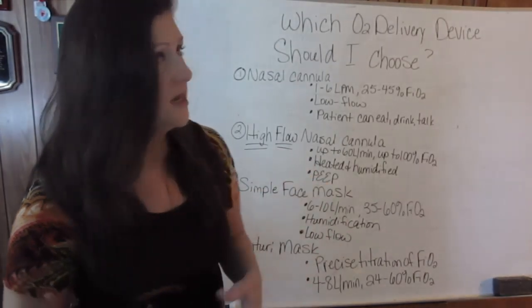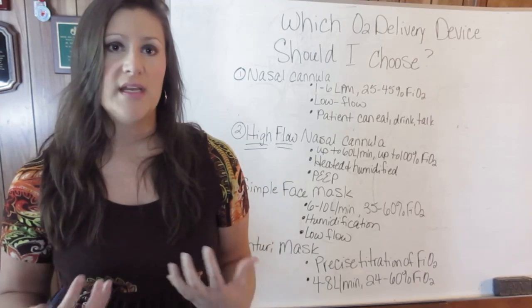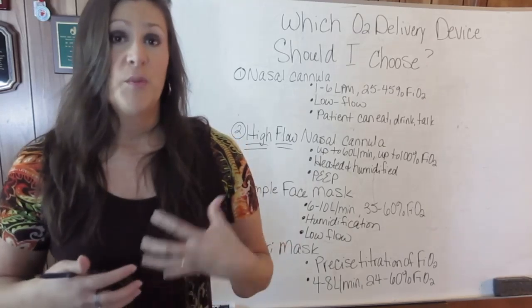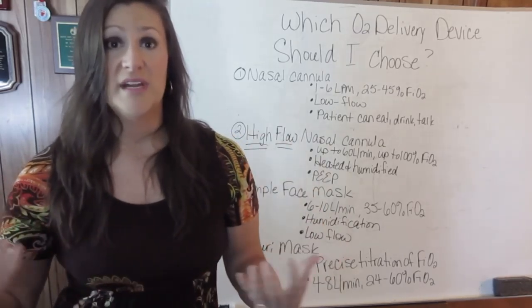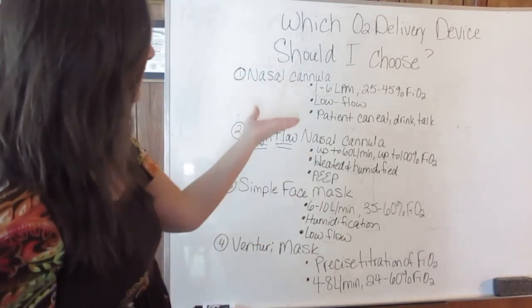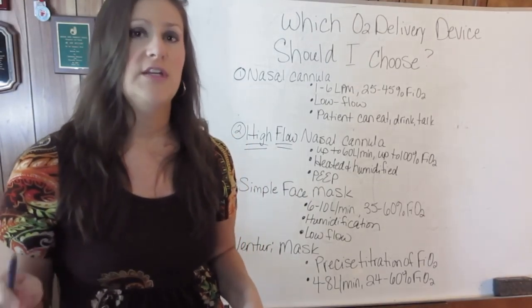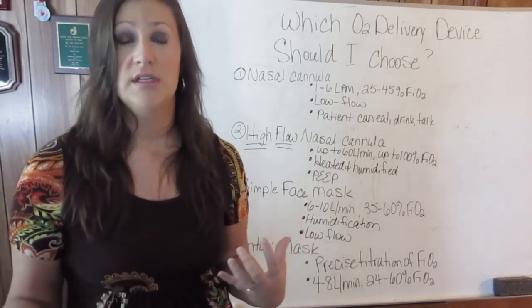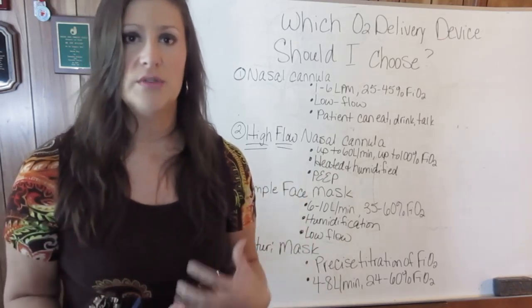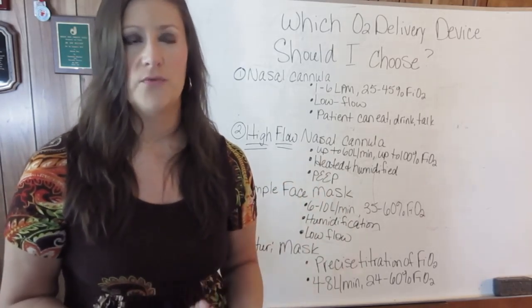But with the high flow, because the flow is so high, it's already humidified, it's already heated, and the greatest advantage is that PEEP effect. And since it's a nasal cannula, the patient can still talk, can still eat, can still communicate, can drink, and do all those things that they can do with a regular nasal cannula. So keep in mind that high flow nasal cannula is gaining more and more attention as a good alternative for clients with COPD that are experiencing acute hypoxemia. They're in acute distress. It's going to help them get that CO2 off.